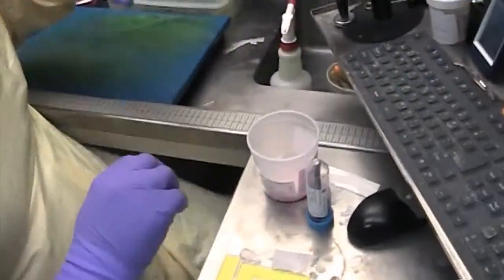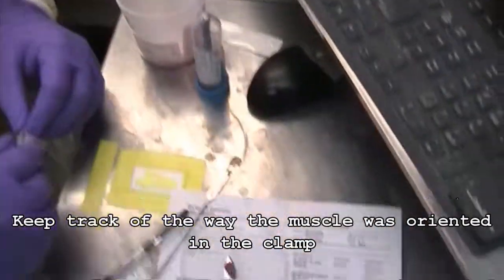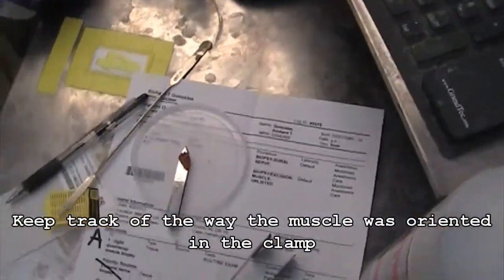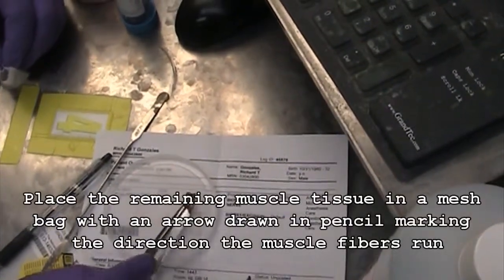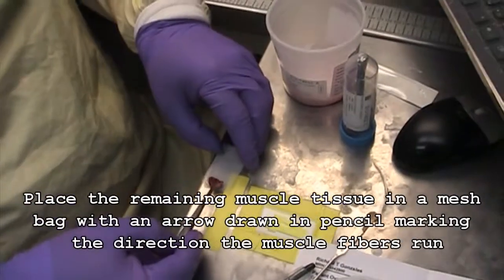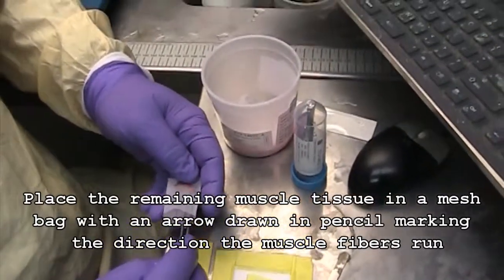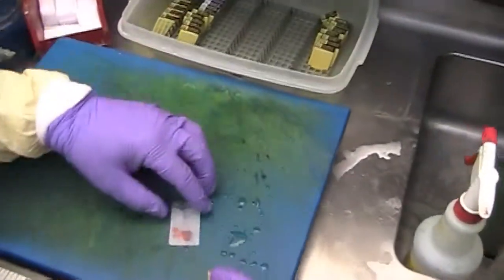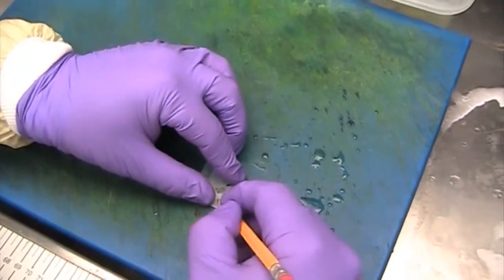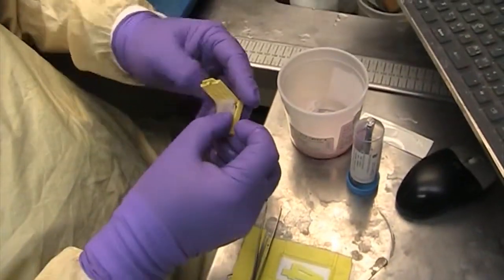The remainder of what you cut off is for histology. And we know that's how we cut it off, so we try to keep the orientation. So you put it in there how you know the muscle fibers are running. And then mark your bag with pencil. You place it in your cassette. And that's histology's part.